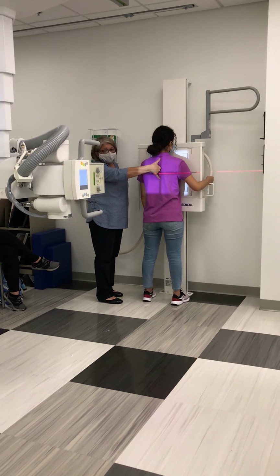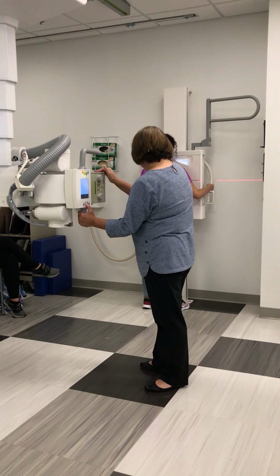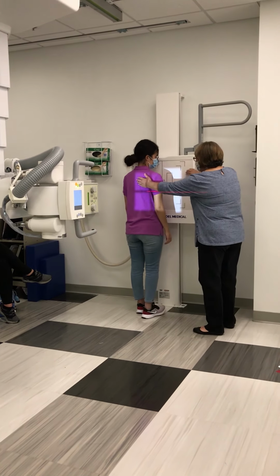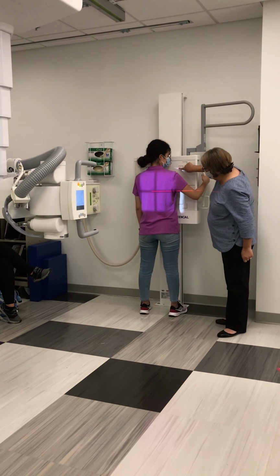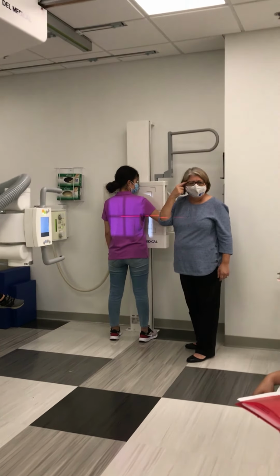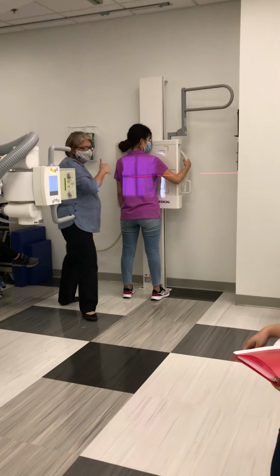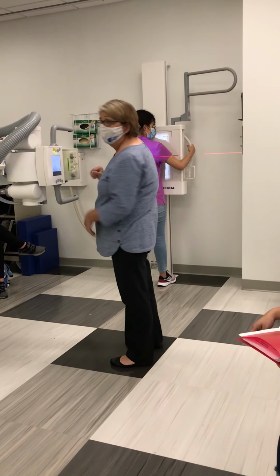So, let's say that I went through this, and let's say that my thumb wasn't on the vertebral prominence, that this is where I measured, and I centered lower. Now right away, go ahead and stand up. Right away, you see I just got like a finger width of light there. Right away that should tell me, oh wait, that centering's not good. Measure again. That's better.